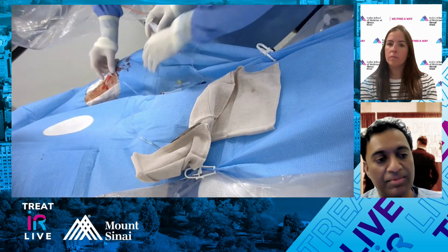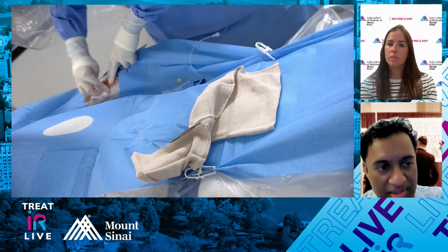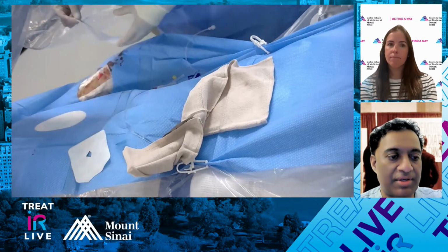Regulate the side flush, please. Can we regulate the side flush? Can I get a 465? Or radial, put a VBX stent into the internal. So that's another option for repair if you want to preserve the hypogastric.